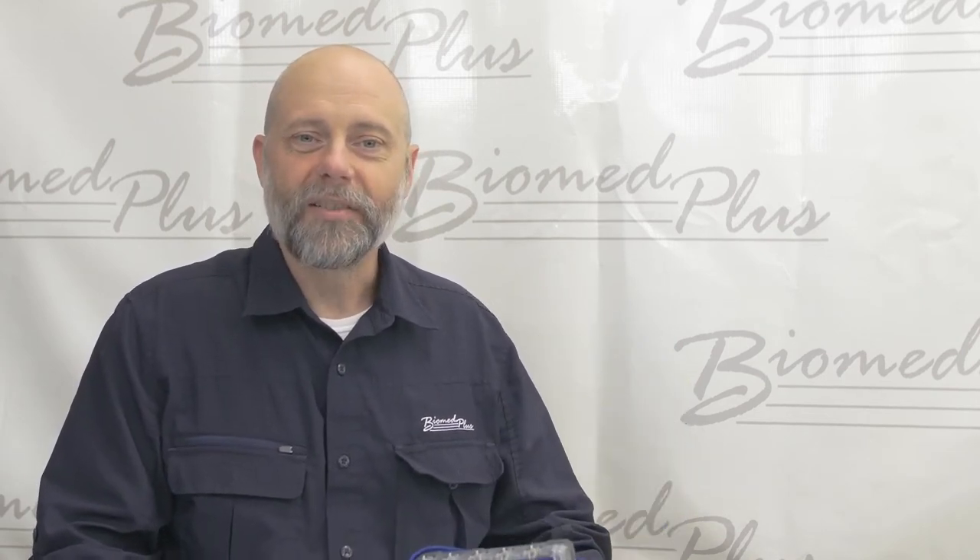Hey folks, James here on behalf of PRONC Technologies, and today we're going to demonstrate the Safety Sim and the Safety Sim app. Together they can help you to work faster and more efficiently to become a better biomed tech.